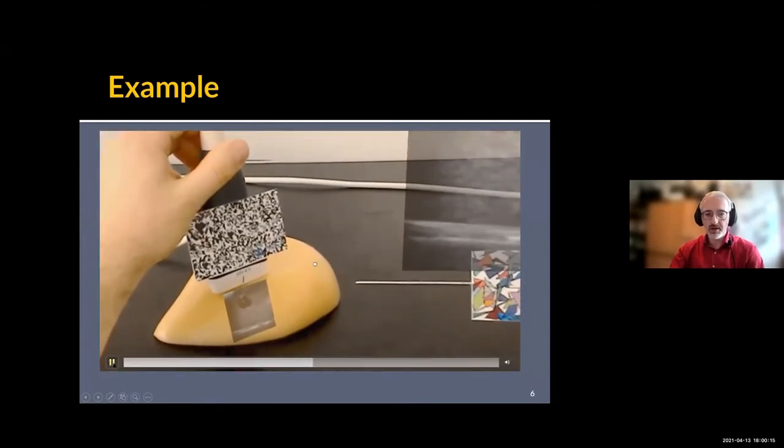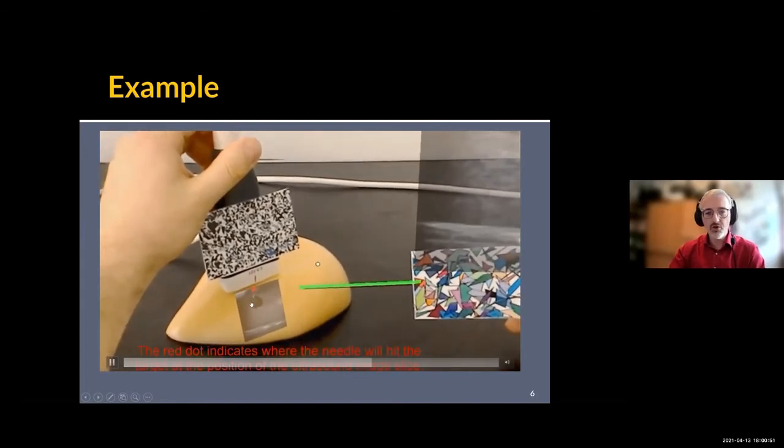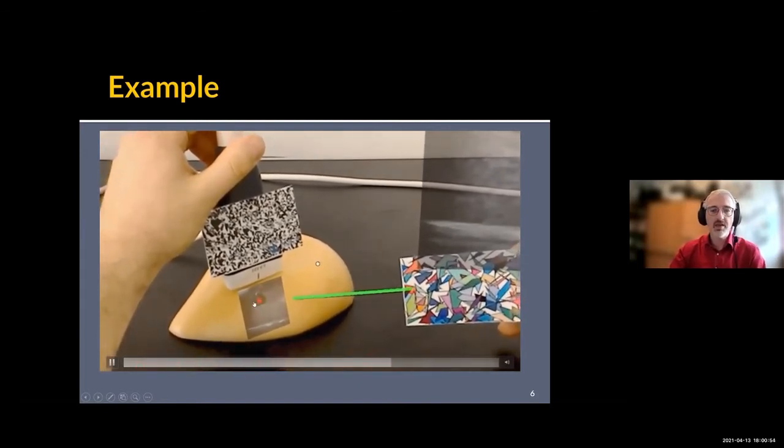We can now have a virtual representation of the needle in a simple green line, and the needle functions as a virtual laser pointer. So if you move the needle along its axis, you will hit the ultrasound image slice exactly at the red point, like if you have a laser pointer in your hand and move along the laser. I would say with such a setup, it's nearly impossible to not hit the mass, if the mass is big enough.